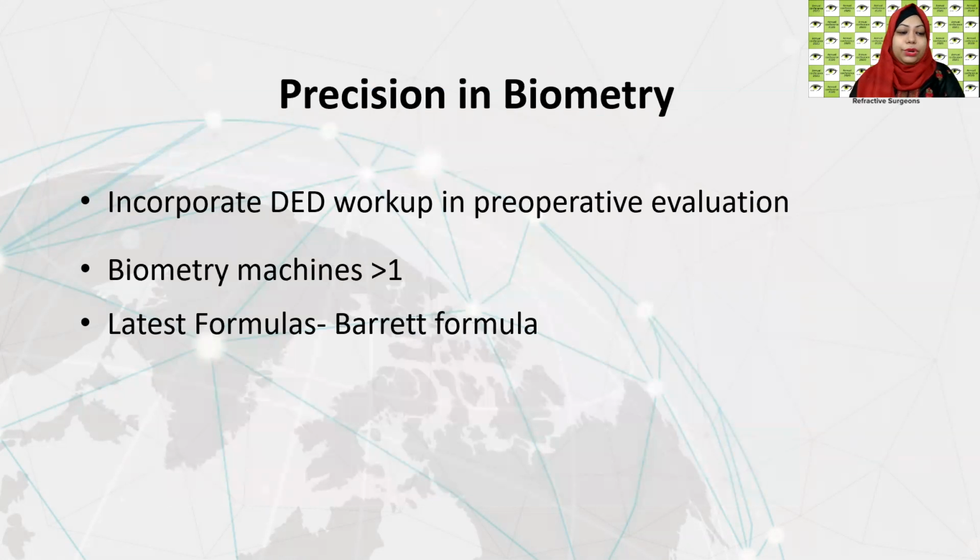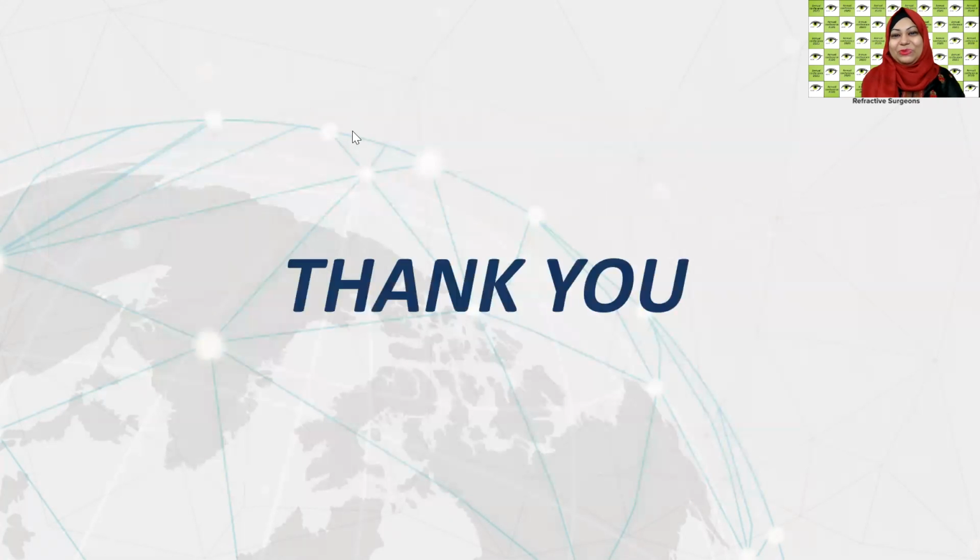And lastly, before ending, I'll say that by incorporating dry eye workup in our practice, by using more than one machine, and one of them should be optical biometers, and by using the latest formula, we will have more perfection in our biometry. We will be able to provide the targeted refraction for the patient. The patient will be happy, and obviously the surgeon will be satisfied. Thank you for your hearing.